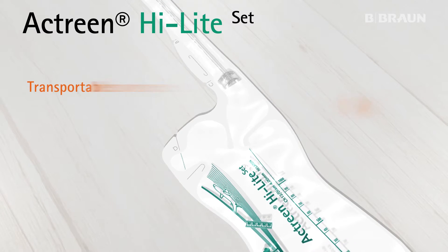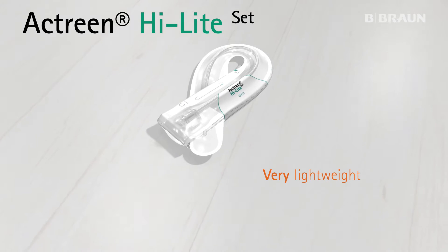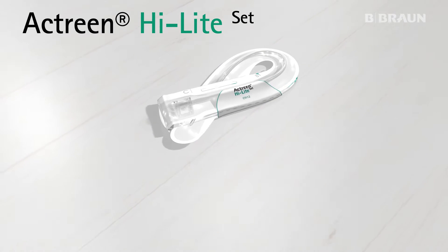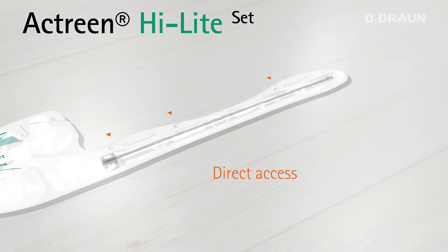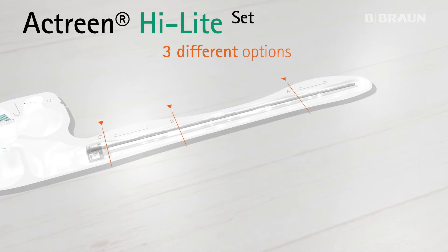This set is transportable anywhere thanks to its foldable shape and it's very lightweight. The Actreen Highlight Set gives you direct access to the catheter, with three different options to open it, depending on your level of dexterity.